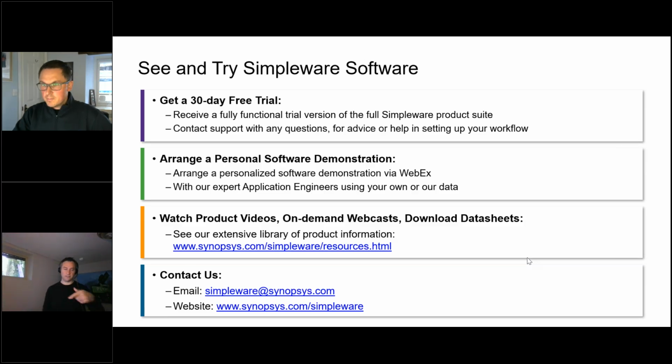And yeah, just to add to that, to give Yale as an example, we had Dan Wisnia, an orthopedic surgeon, and now we're doing Custom Modeler on neuro. Basically, I just planted the seed, told him, hey, we have this capability if this is of interest to you or your colleagues. And he had a colleague in the neural group and they had this application that said, hey, I think Simpleware can help with this. And this was a year or two ago.